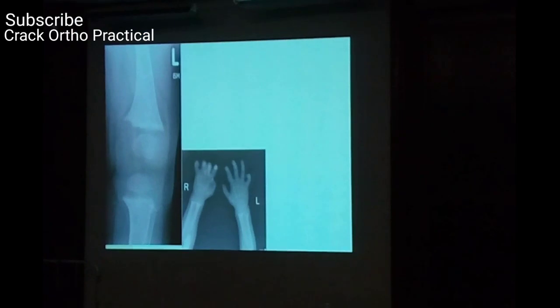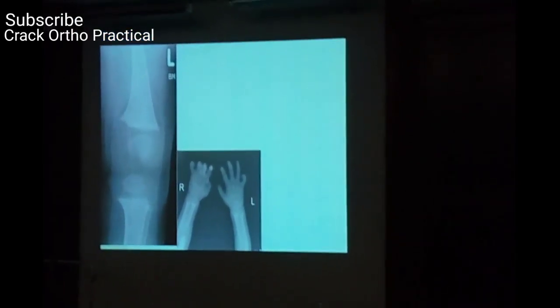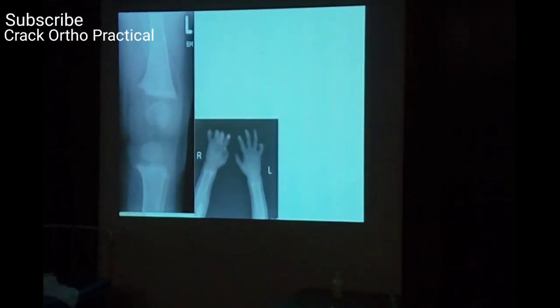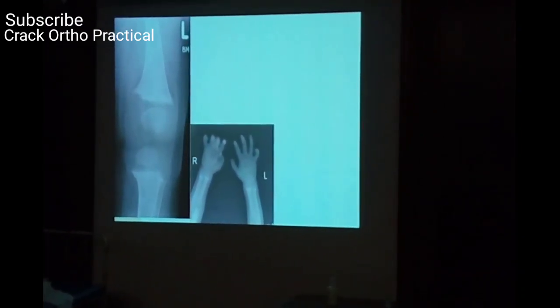Easy. Who is describing this one? Plain X-ray, plain radiograph of a.